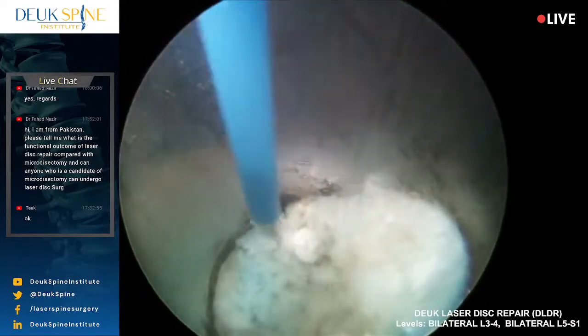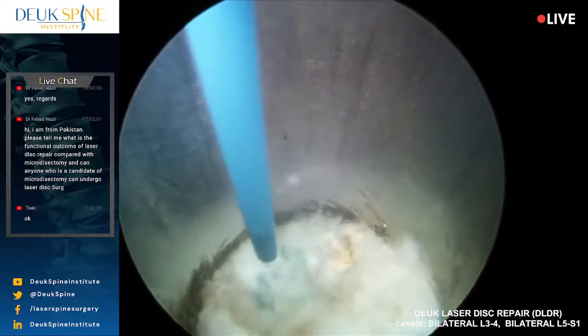All right, five more minutes on this disc, then we finish with the last disc.